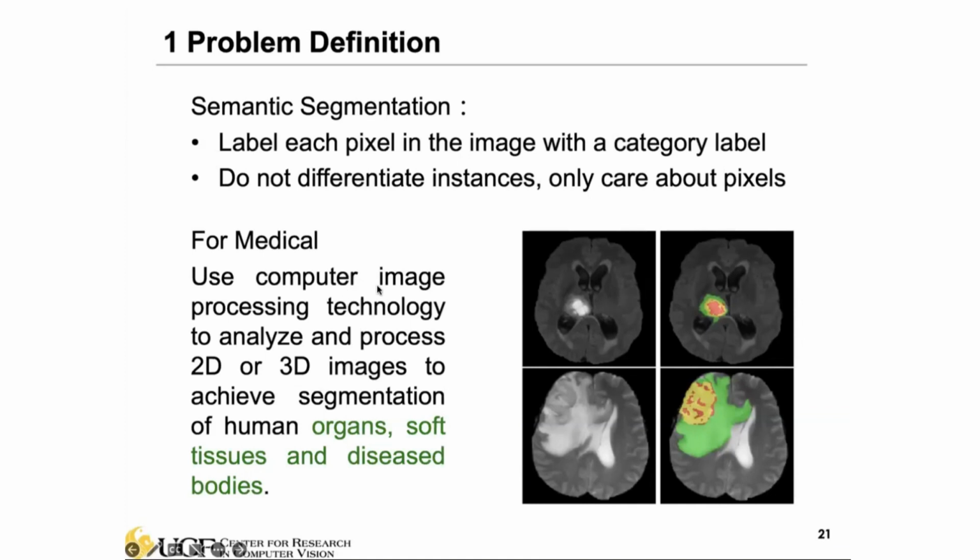Unlike natural images, where we mostly deal with 2D RGB images, medical images such as MRI or CT, as we discussed in the lecture on different modalities of medical data, not only have the spatial dimensions but also slices, corresponding to different cross sections of the body. So they are considered 3D volumes, and we want to do volumetric segmentation.